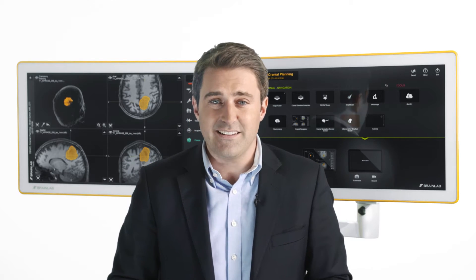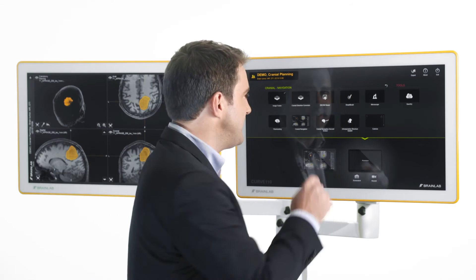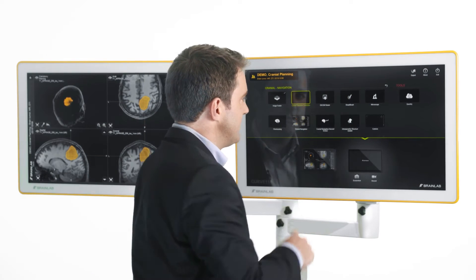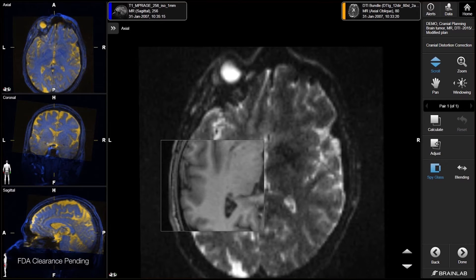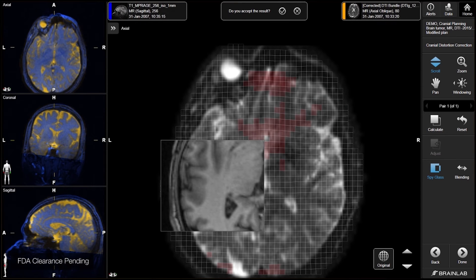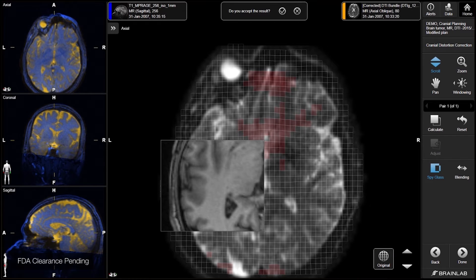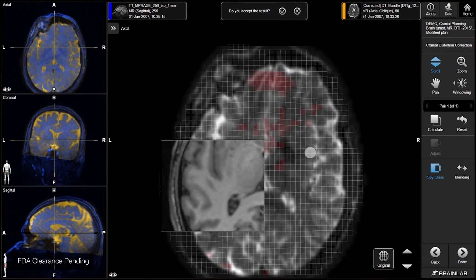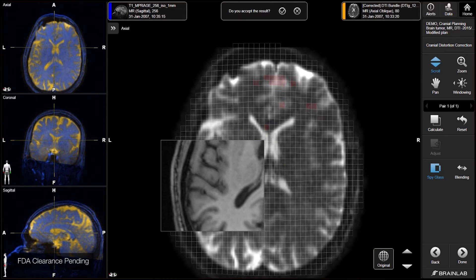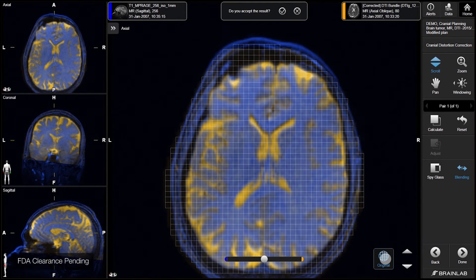DTI data is inherently more distorted than standard navigation scans. With new Elements Distortion Correction, a special fusion algorithm creates a new, more accurate DTI dataset that is then used for processing. This avoids visualization of misplaced fibers on the navigation dataset.